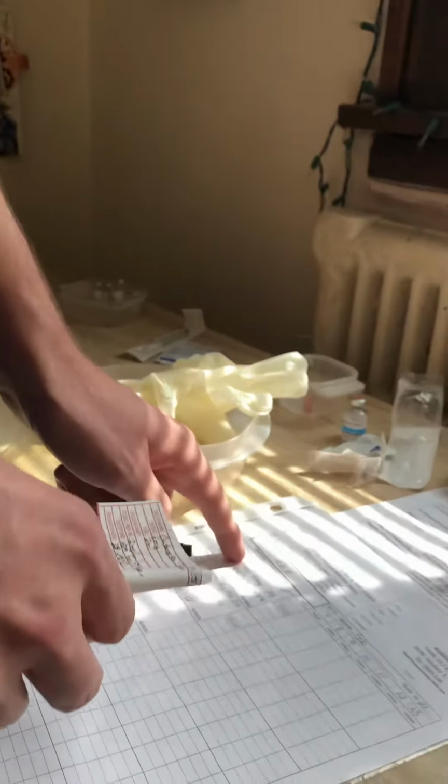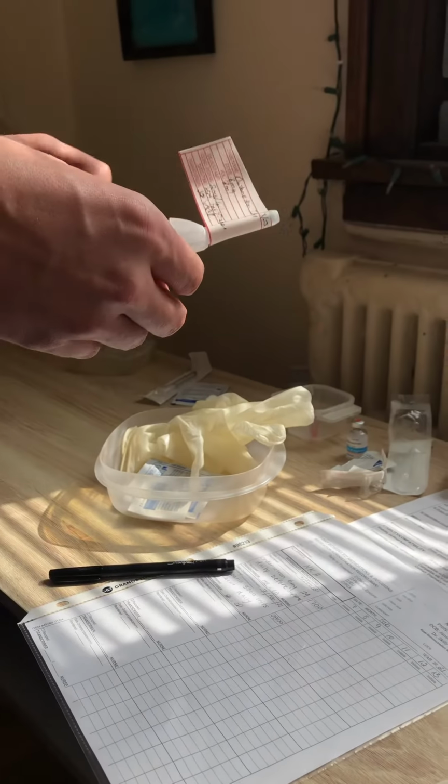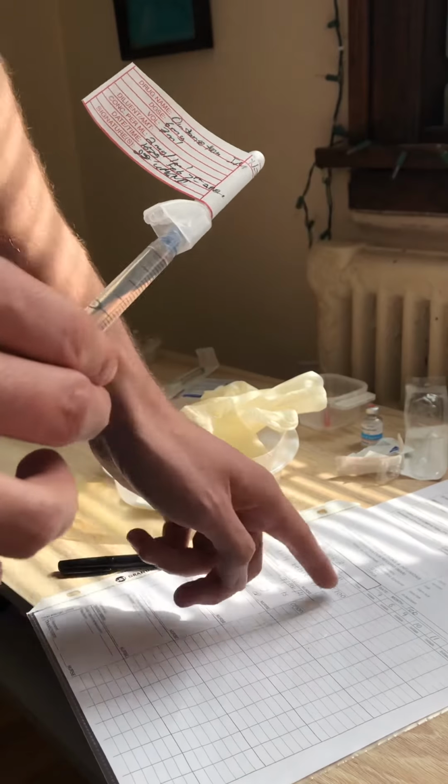So right patient, nursing Jake, right medication, ondansetron, right dose, 6 milligrams. Concentration is 2 milligrams per 1 ml, that's why I have 3 ml. Right route is intramuscular, and right time frequency is daily. For 1700 it is 16:35, it is safe to give.